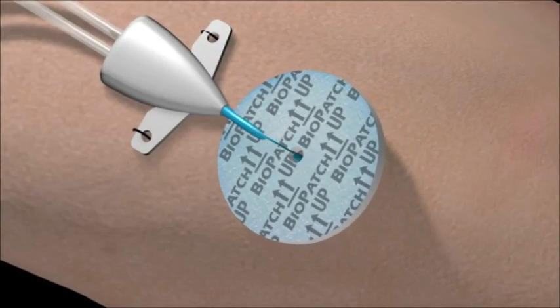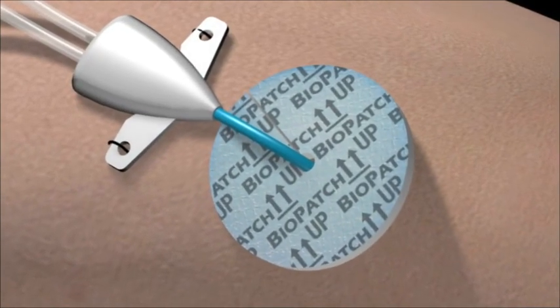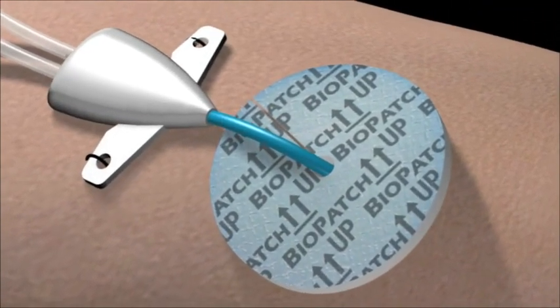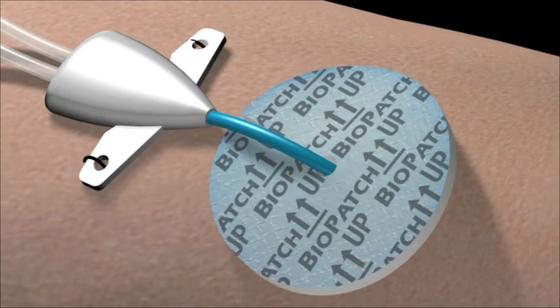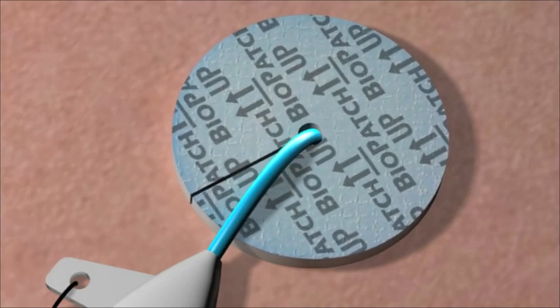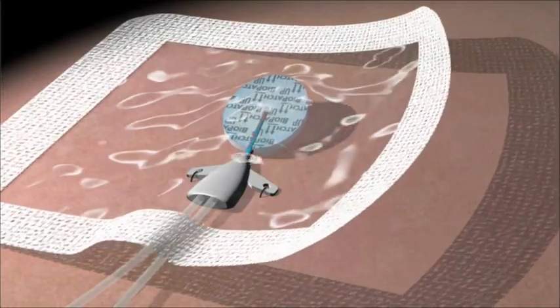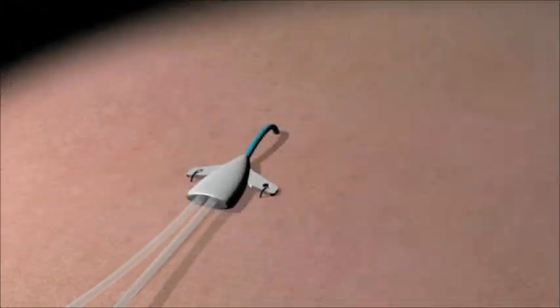Place BioPatch around the catheter or pin site with the CHG impregnated white foam side in direct contact with the patient's skin. Make sure that the BioPatch is not laying on top of the catheter hub. When aligned properly, the pre-cut slit allows for easy release of the catheter when the transparent film dressing and BioPatch are removed.